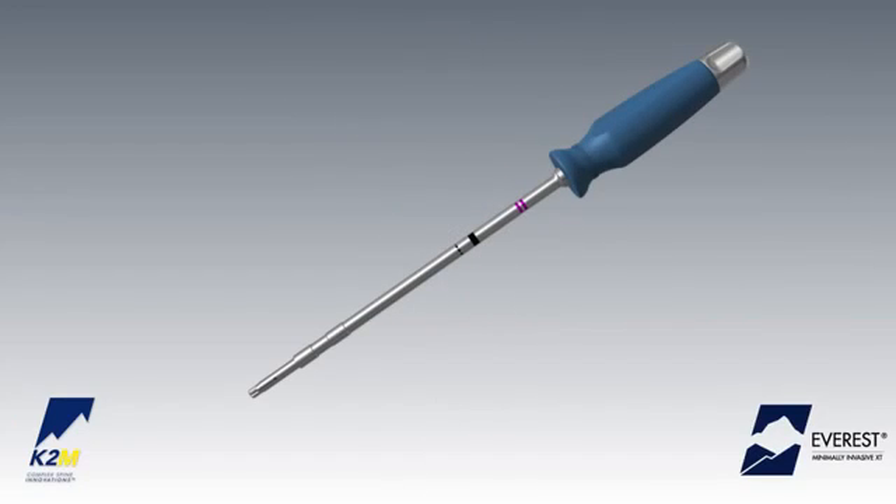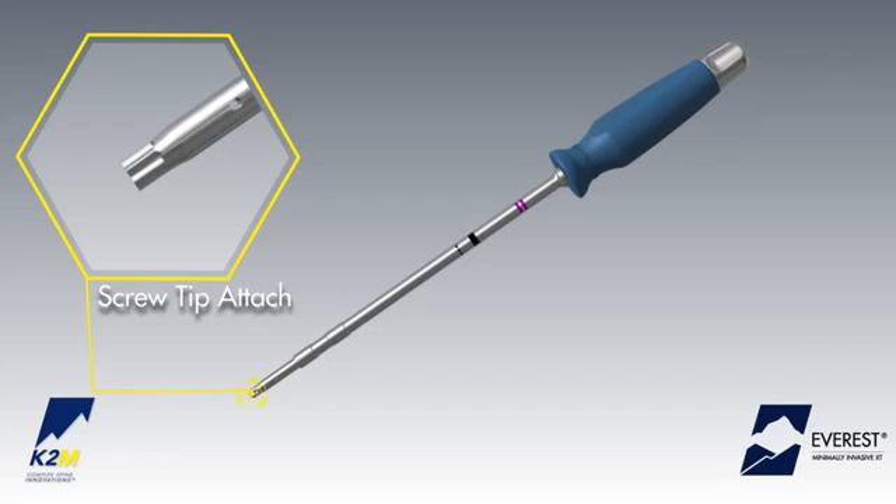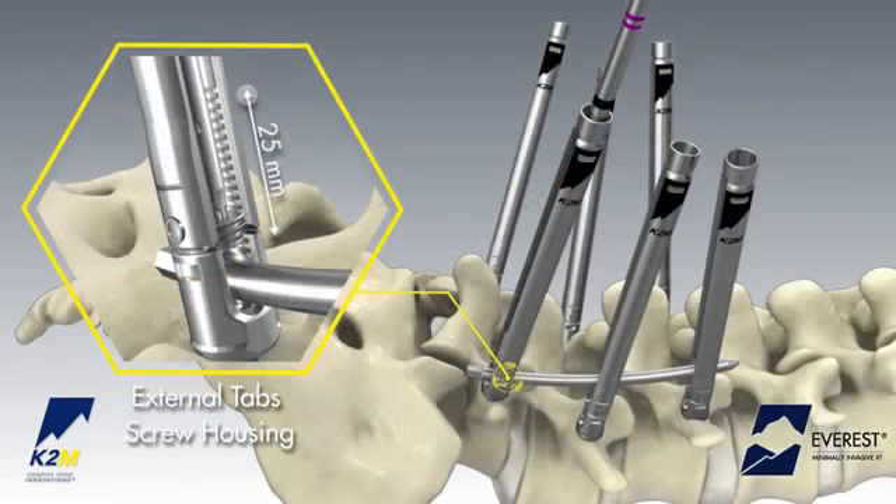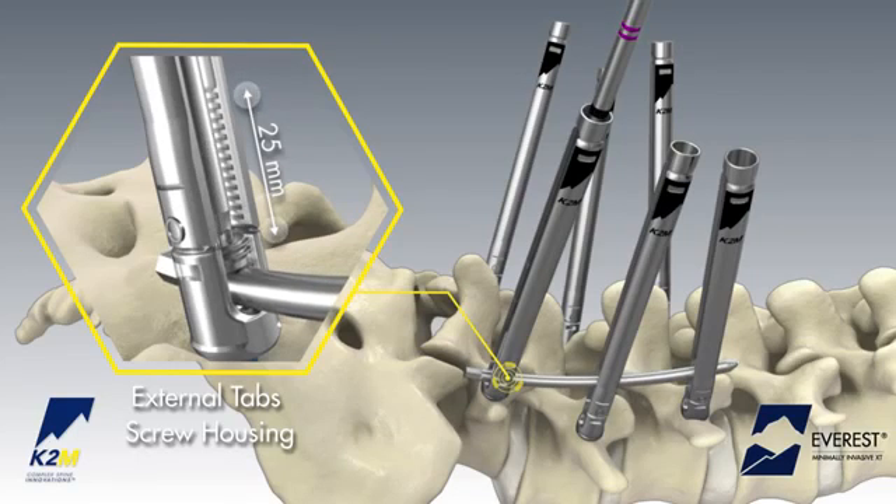Attach the set screw to the split tip provisional driver by first rotating the dial of the driver counterclockwise to the open position. Engage the split tip of the driver with the set screw and rotate the proximal dial clockwise to secure the set screw to the driver. Thread the set screw between the extension tabs until the rod is secured within the tulip.